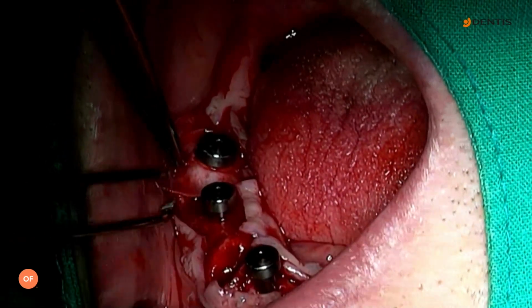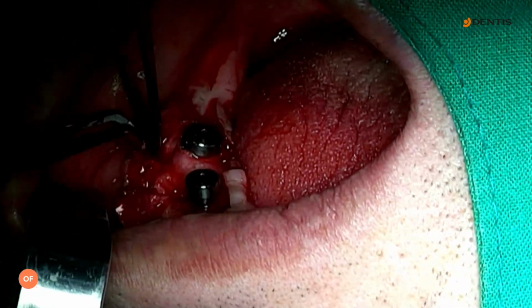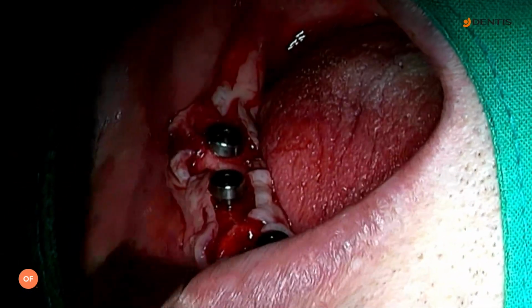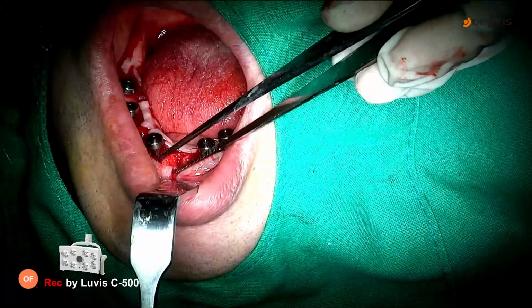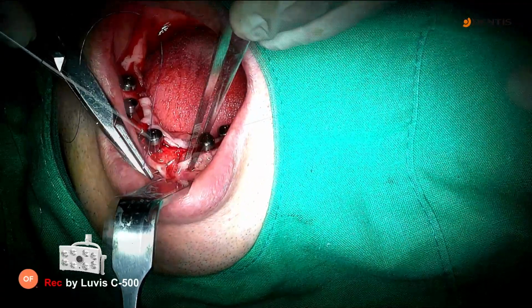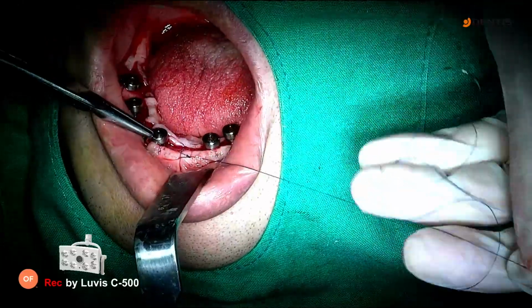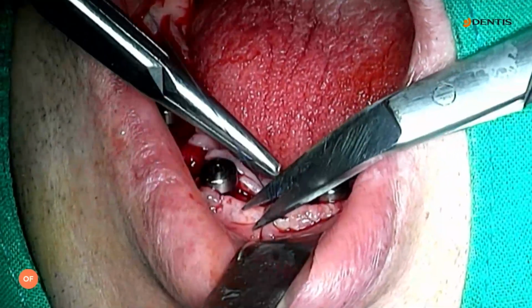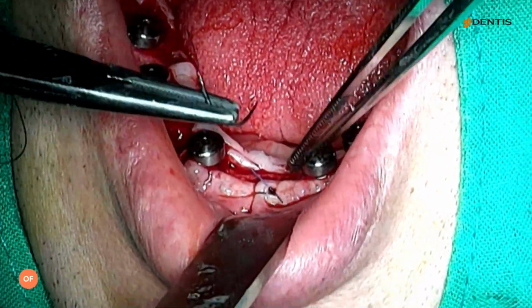Yesterday, I briefly commented on healed ridge area surgery, and the immediate placement surgery is the big two categories for implant surgery. Okay, now I'll start the suture. Usually with a vertical incision, suture first. Okay, one by one, simple interrupted suture.